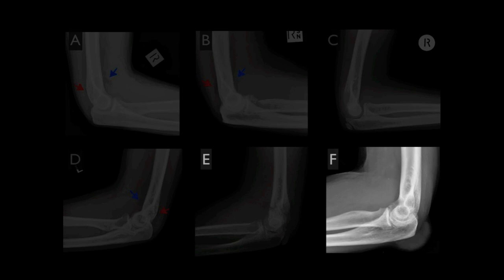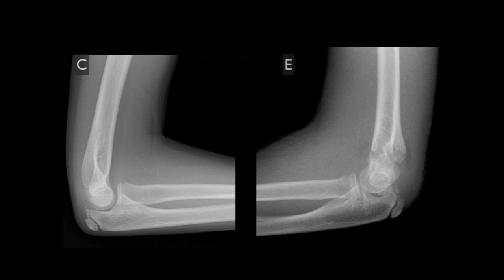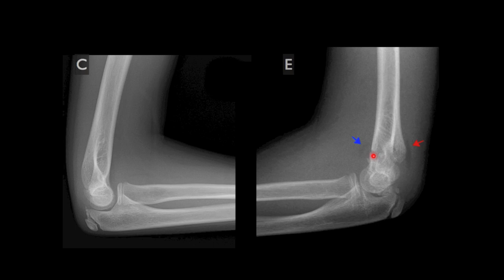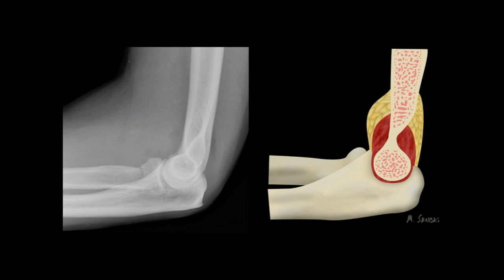F is our friend with chronic gout, who does not have an elbow joint effusion, while C and E are paediatric patients. C is the normal example without a joint effusion, and E is a patient with an elbow joint effusion related to a supracondylar fracture, which is the most common cause of an elbow joint effusion in children.